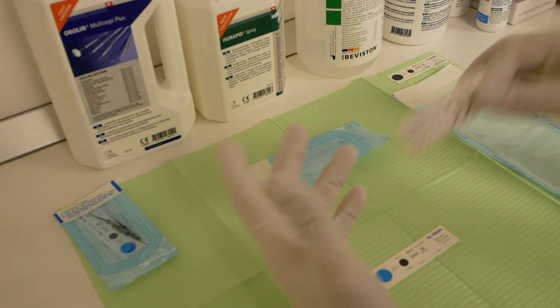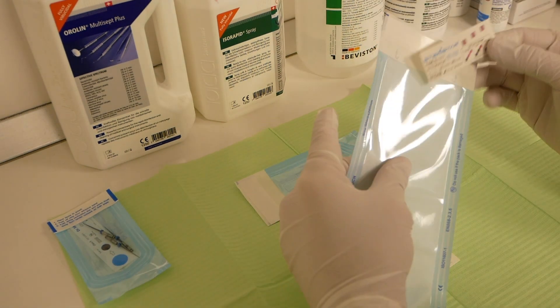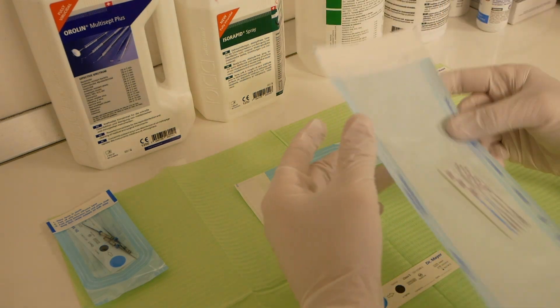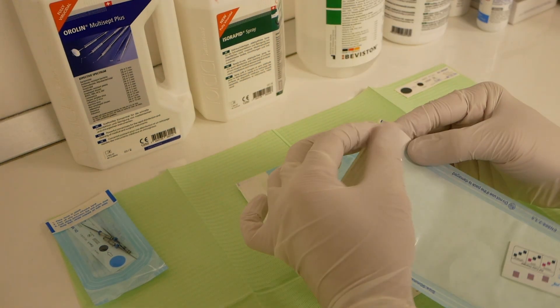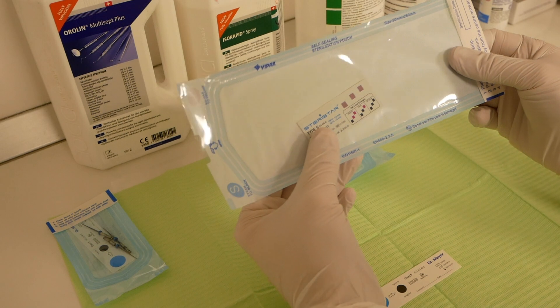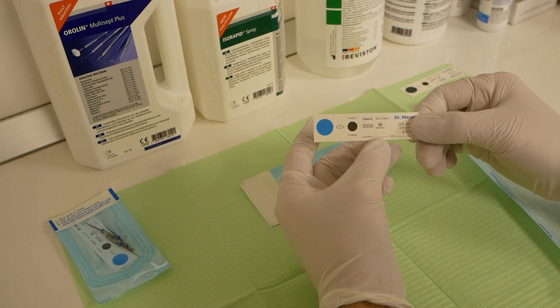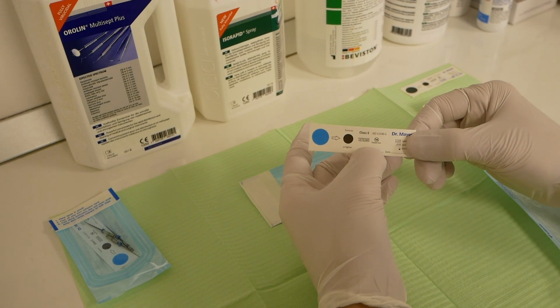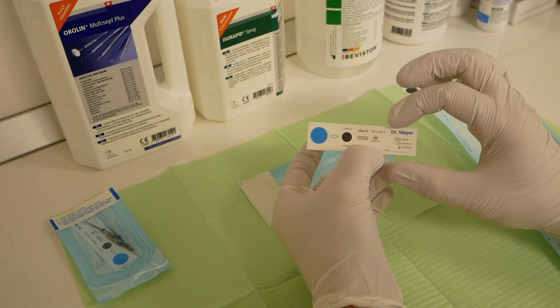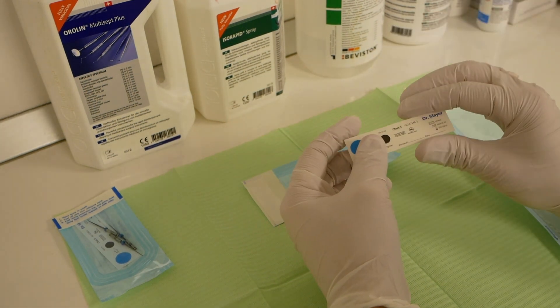So basically all you need to do is put your instruments inside the pouch, put a Class 5 indicator strip inside the pouch, peel off the adhesive strip and seal the pouch. Some countries require you to have the sterilization batch number written on the actual strip, as well as the date — some don't, depending on your country's legislation.